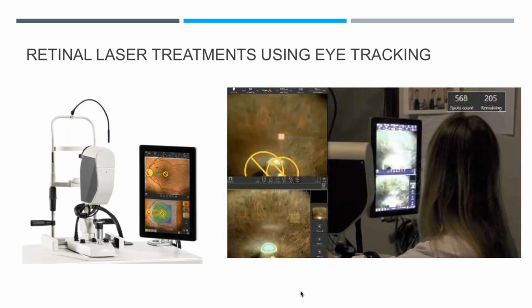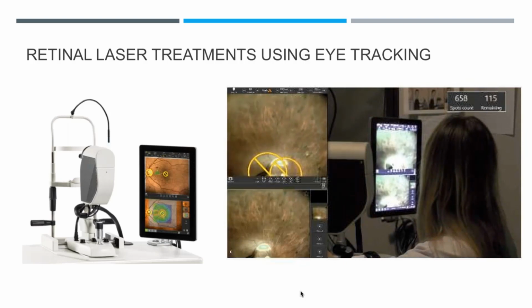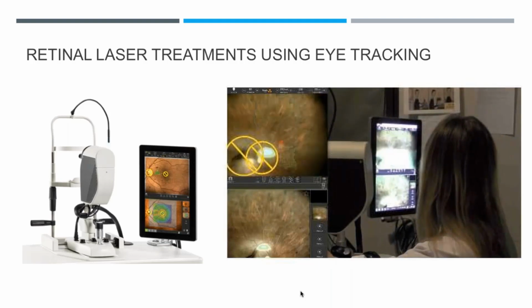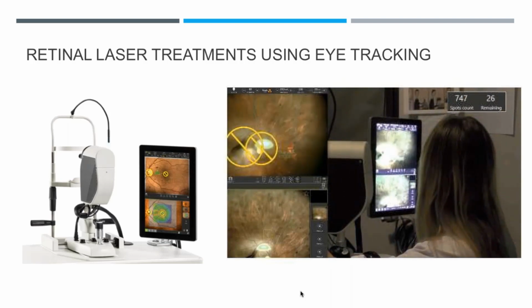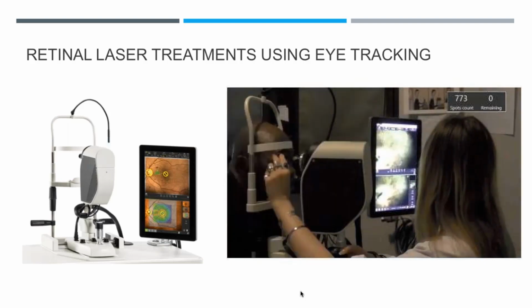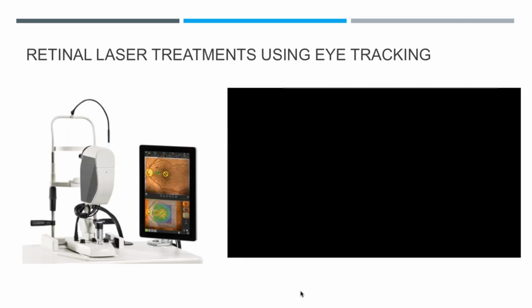retinal laser photocoagulation, which can be used both for posterior segment disease and peripheral disease, such as in this case. And the yellow circles show protective zones where we do not want the laser to be applied. And this is all done in vivo with actually online navigation. So much usefulness of this technology.